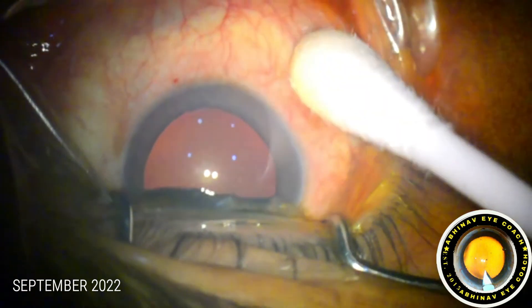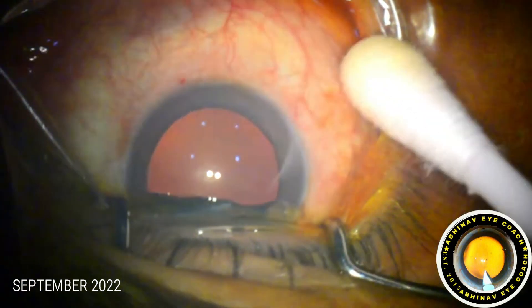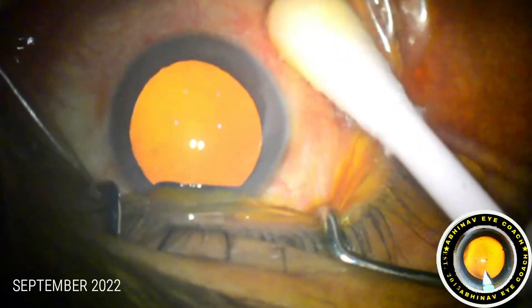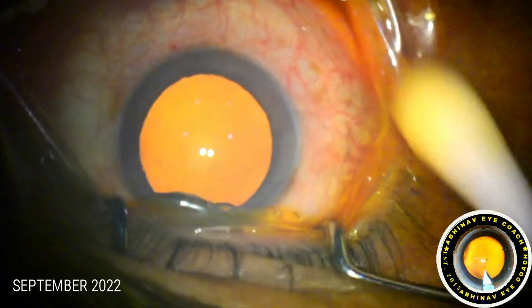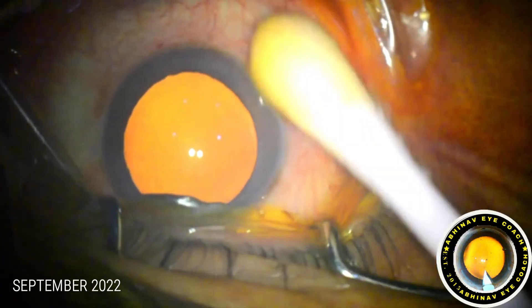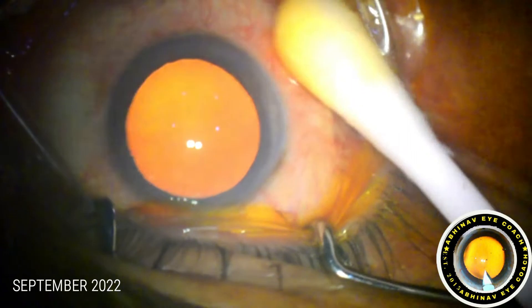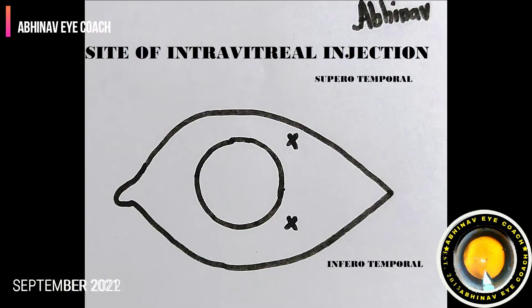The eye is draped, topical antibiotic and anesthetic eyedrops are instilled inside the eye. The site of intravitreal injection is supero-temporal or infero-temporal to the limbus. We have to measure the distance from the limbus before giving the injection.